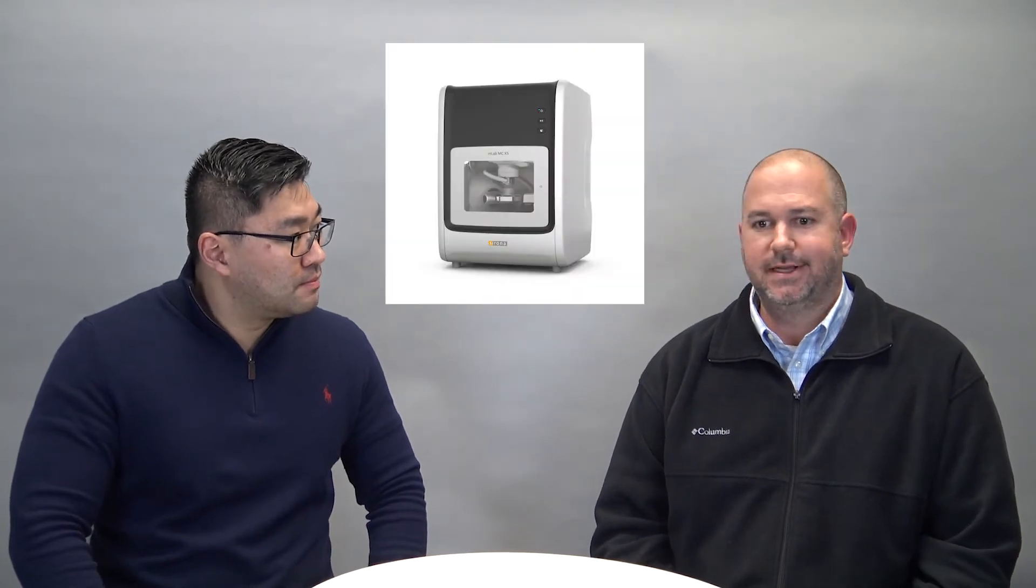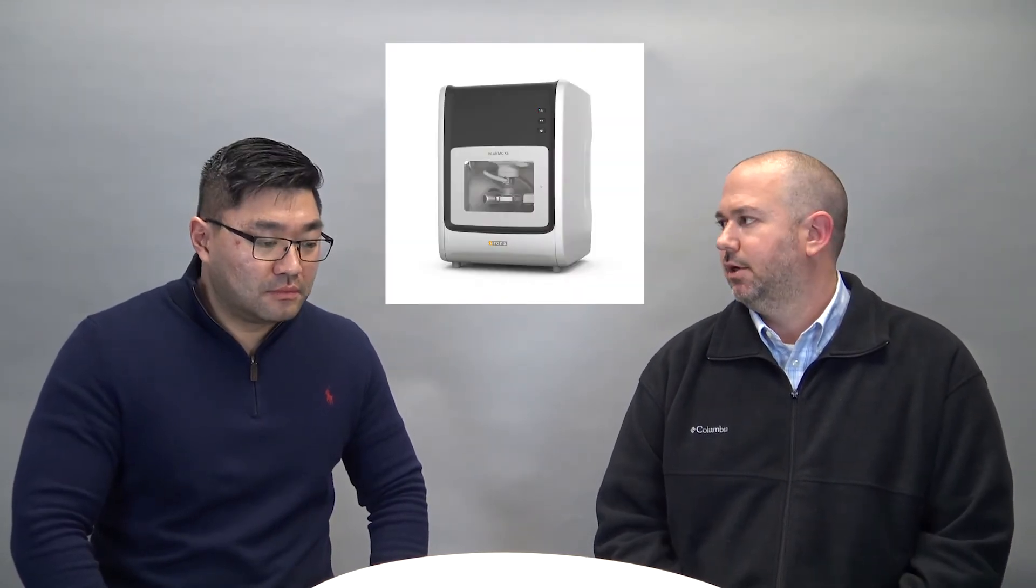Then we can export it to CAM or export it as an STL to use another system. What's great about the CAM software is each mill that I have, the MCXL and the MCX5, they both come with the CAM software. So if I want to mill an Emax on the MCXL, it mills wet, mills in about 10 minutes. We can offer a lot of same-day fast turnaround type cases.